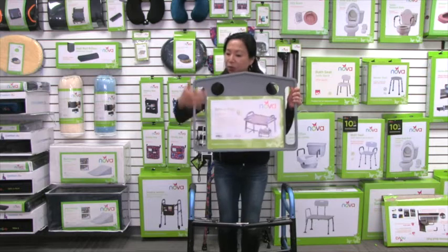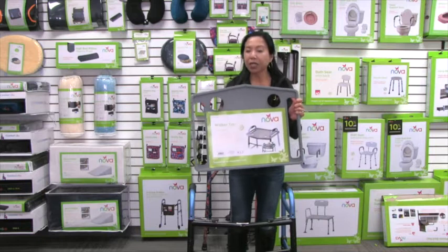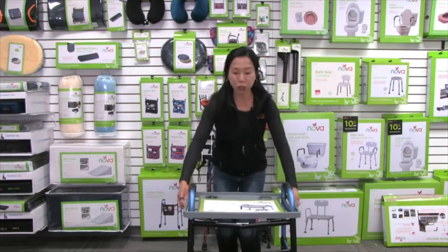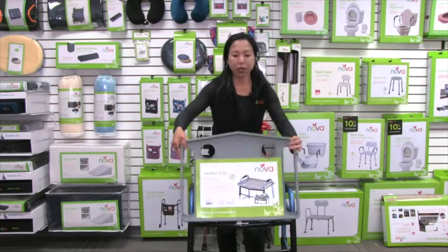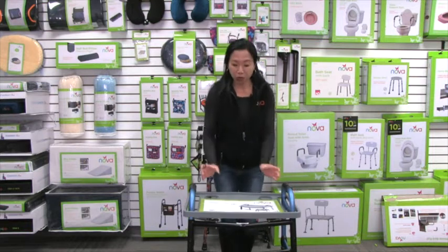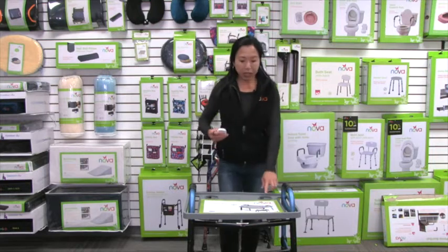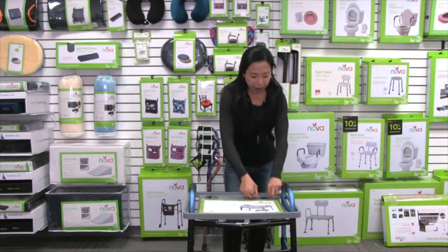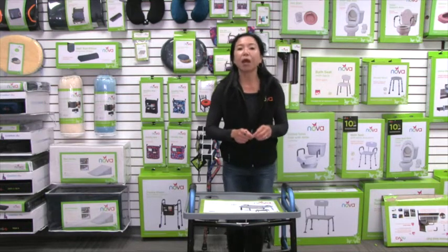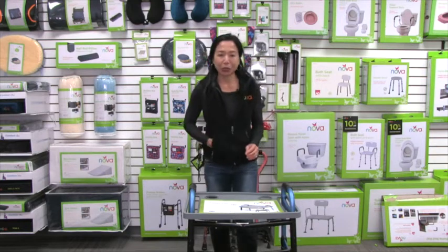The food tray looks like this. We've got two cutouts here that go over the handles, and two cutouts here for the cup holders. The cup holders are going to face the back, towards you. The food tray has a slightly pointed area — that's going to point towards you, so when you put your drinks there, they won't hit the front bar. Note that these cutouts are only about two and a half inches wide, so the diameter of your cup has to be around two and a half inches or less to fit into the cup holders.